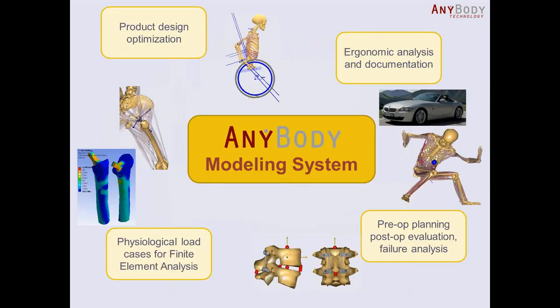So the AnyBody modeling system can then be used for many different applications. For example, it's used in product design optimization. So there are these optimization studies. You see here a picture of a wheelchair. You can make an optimization study to find the optimal position of the axis of a wheelchair to get the lowest joint reaction forces in the shoulder, for example. But this can also be done for different products such as bicycles or whatever you can imagine.